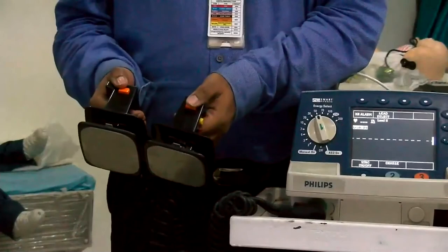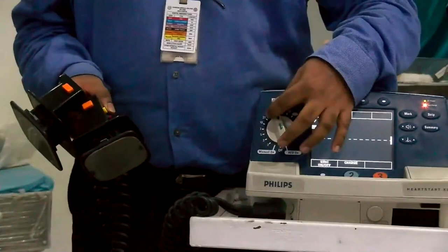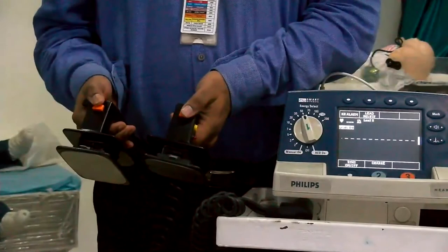So 3 steps: you take the paddles and put gel, select the appropriate paddles, and then you switch on and select the joules and charge, either through the button, pressing the yellow button over here, or in this. And then third is just delivering the shock.